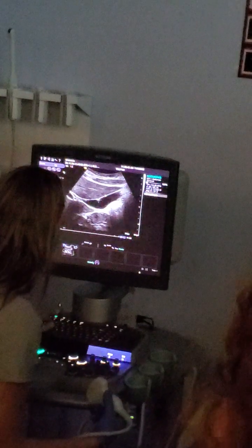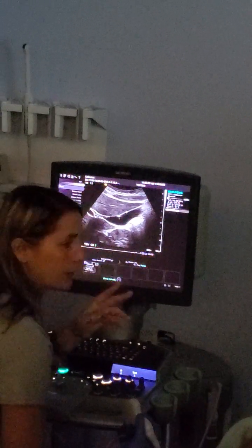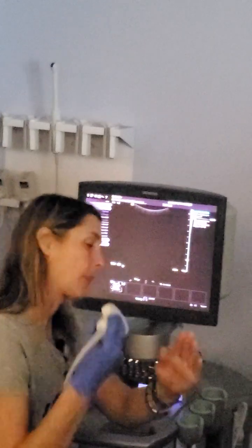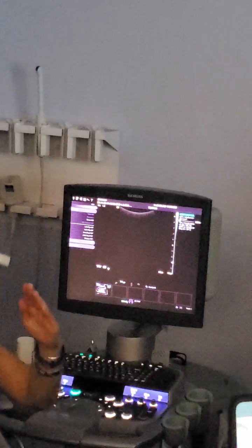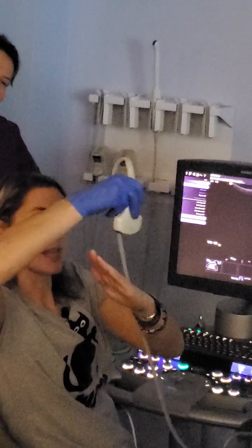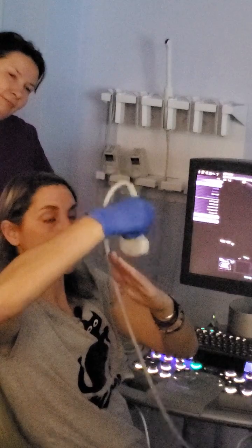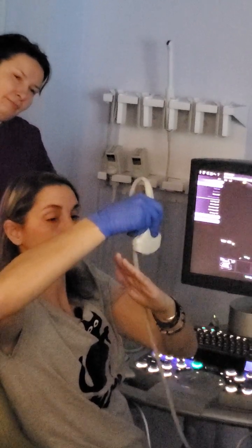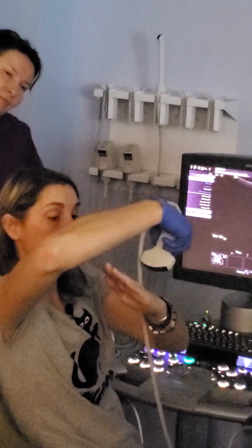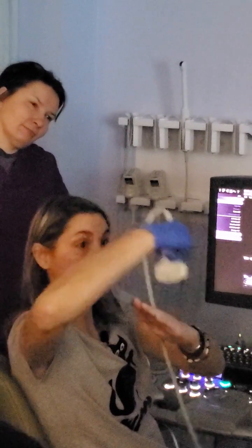Okay, so for transverse gallbladder, we're going to try to get representative images of the neck, body, and the fundus. This gets kind of goofy. If my gallbladder is angled like this in my body when I'm looking at sag, and I go to transverse, I'm going to be oblique on my transverses. So the angle that I have in sag indicates to me where I need to go in transverse. In this case, I would need to go superiorly and scan inferiorly to get a true transverse of my gallbladder. Does that make sense?